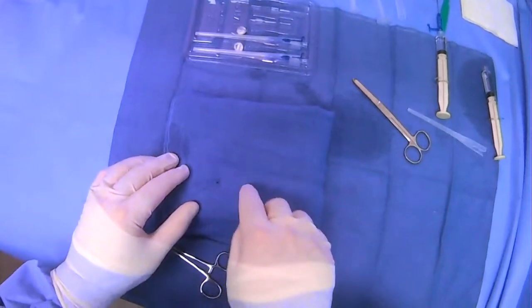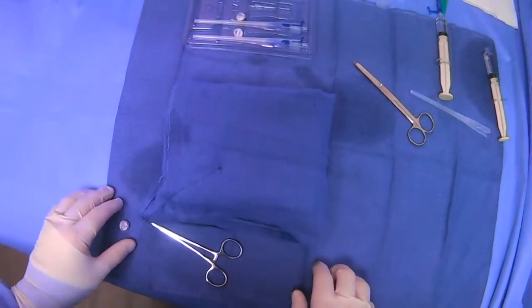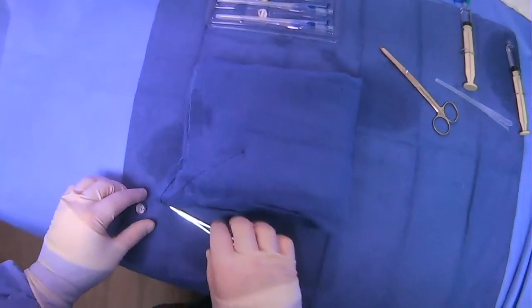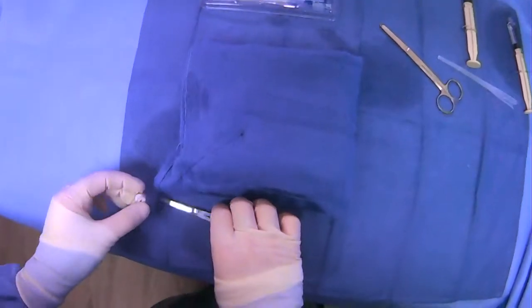And then we'll place our other ones kind of in a triangle, triangulating where we're going to put the actual tube. But let's say we've put in our other ones.